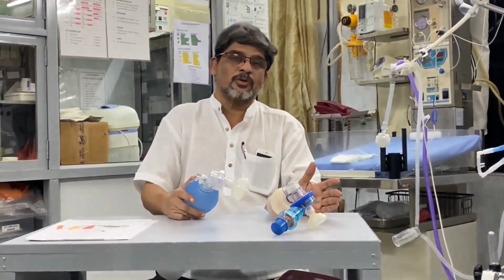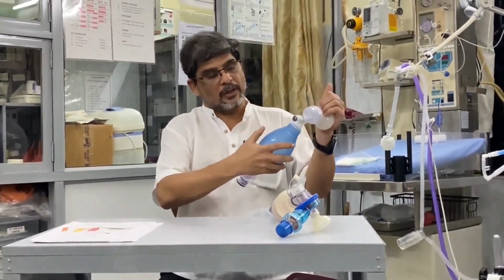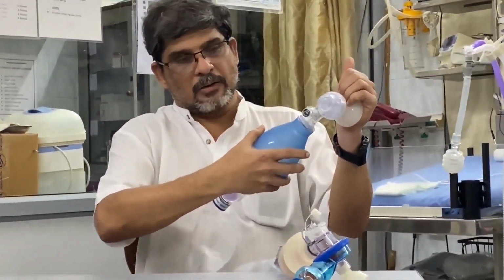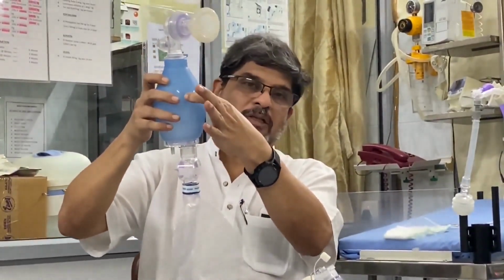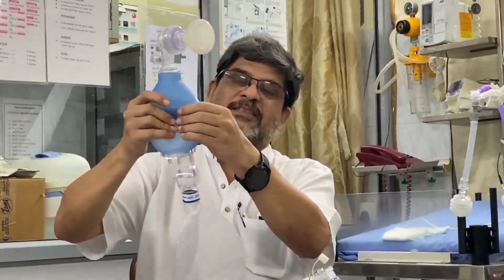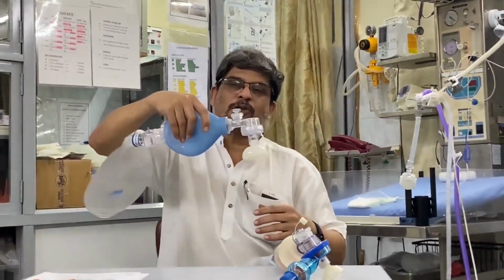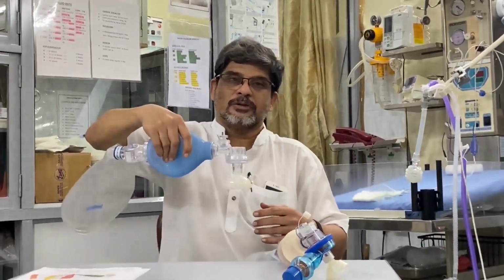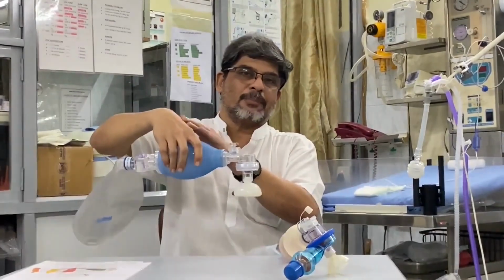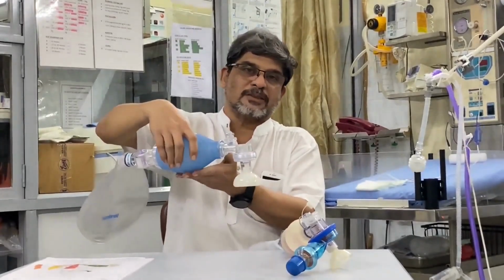What we do here is something known as positive pressure ventilation, which is non-physiological. With the reservoir, which allows air and oxygen to mix to give a particular concentration of oxygen in this chamber, we press this chamber and generate a positive pressure to push the air into the lungs of the child or an adult. So this is called positive pressure breaths. The amount of pressure we generate is called peak inspiratory pressure. That maximum pressure with which we push the air into the lungs is called peak inspiratory pressure.